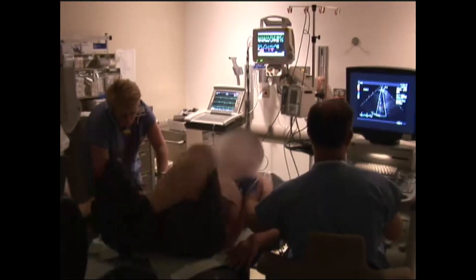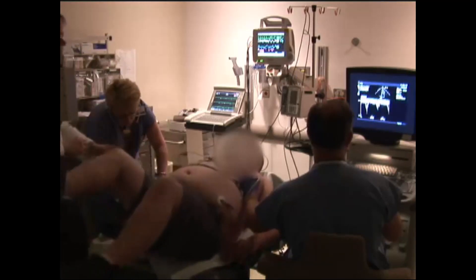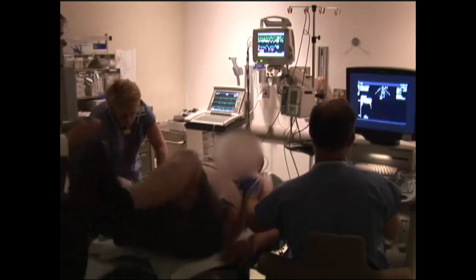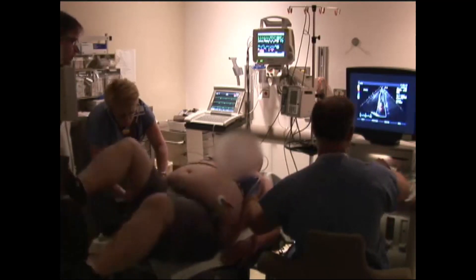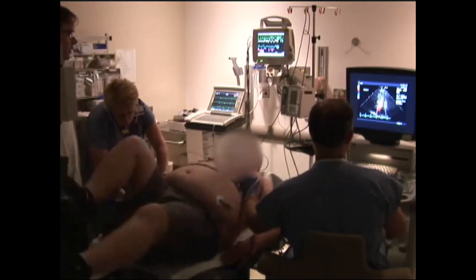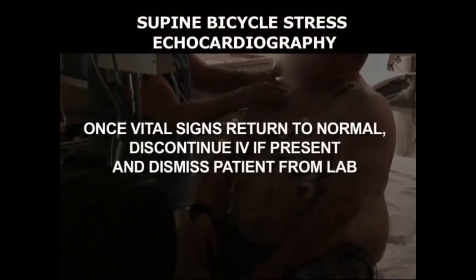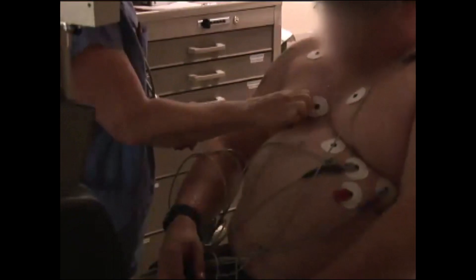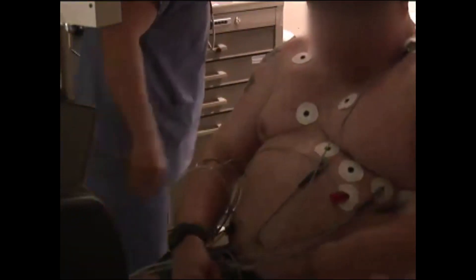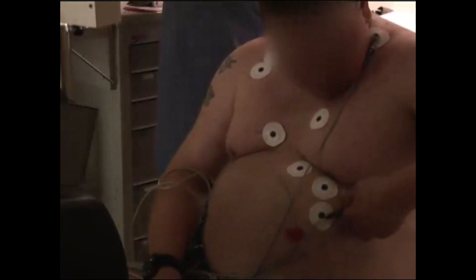Heart rate response to supine exercise is often lower than with treadmill exercise. Allow the patient to cool down by continuing to pedal for one minute without resistance, then unstrap the patient's feet from the pedals. Once vital signs have returned to normal, patient monitoring can be discontinued. If an IV is present, this should be removed prior to discharging the patient from the lab.